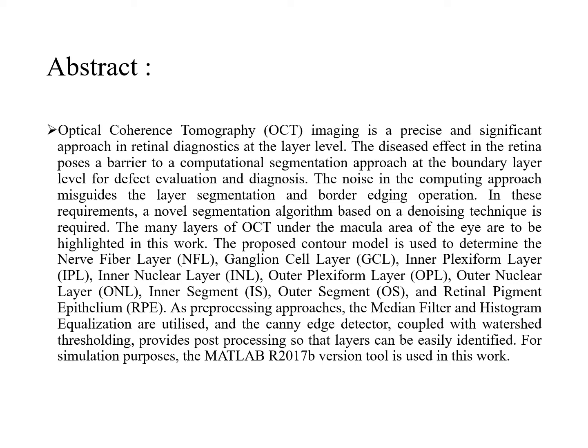Coming to the abstract, optical coherence tomography imaging is a precise and significant approach in retinal diagnostics at the layer level. There are many layers of OCT under the macular area of the eye to be highlighted in this work. The proposed contour model is used to determine the nerve fiber layer, ganglion cell layer, inner plexiform layer, inner nuclear layer, outer plexiform layer, outer nuclear layer, inner segment, outer segment, and retinal pigment epithelium.